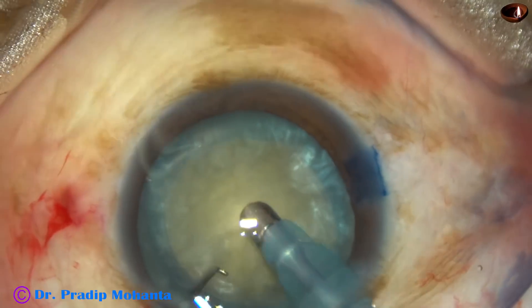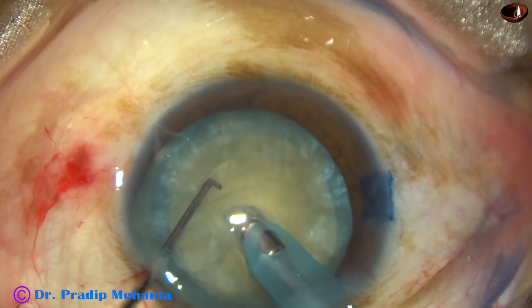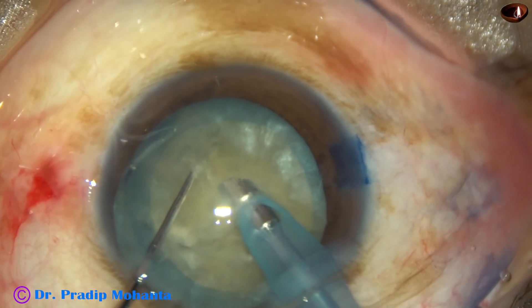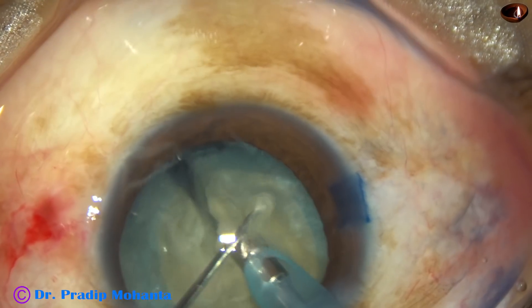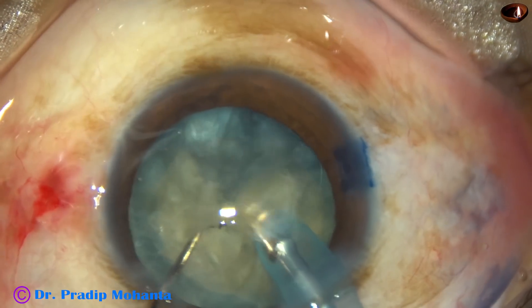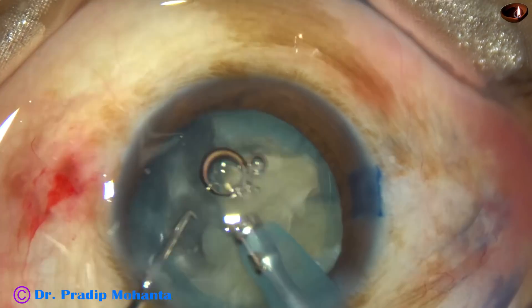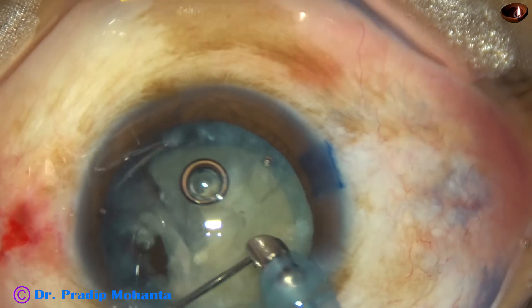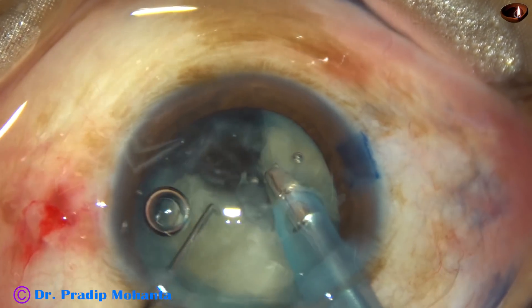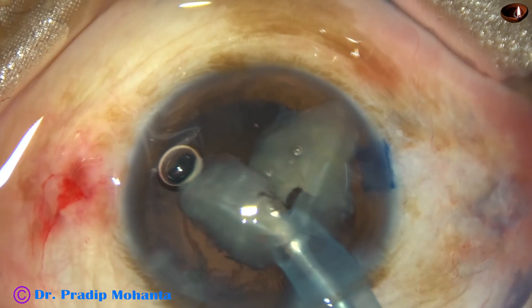And now I go bevel down, embed the teeth, and chop it. I got inspired by my friend Dr. Jayant Hale of Maharashtra to hold the nucleus in this way with bevel down. So far I was afraid of holding the nucleus with bevel down, but it's not so. Towards the later part of the surgery, we can make the bevel up, but for the initial steps, we can keep it bevel down.